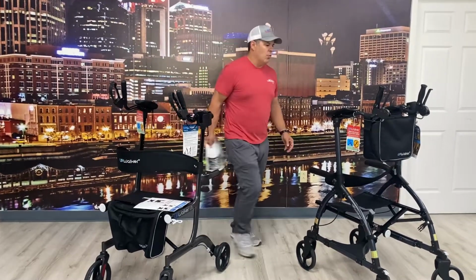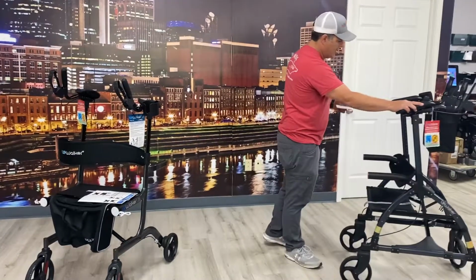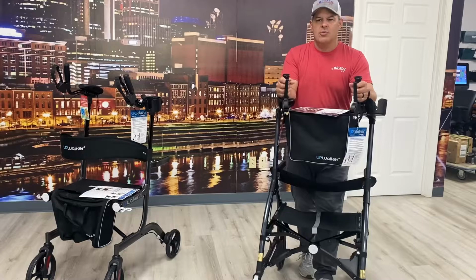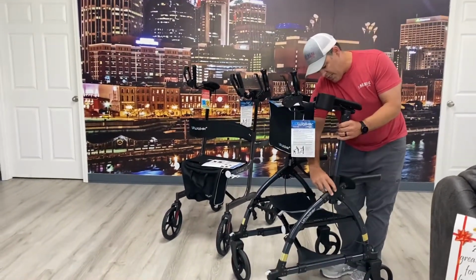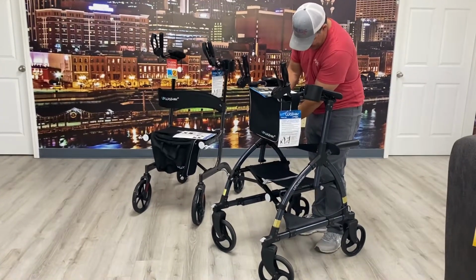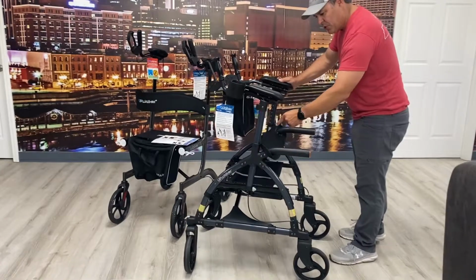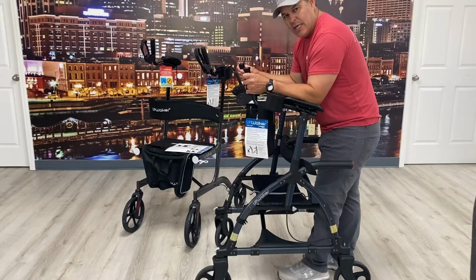So the original one has all the bells and whistles. It's a very nice device. It really works well for somebody that is wanting to stand upright. You can adjust these handles up and down. They're actually numbered, as you'll see right here, so you can always make sure they're matched up, but you can adjust them to whatever height you need.